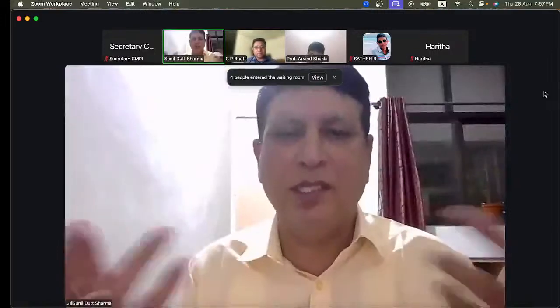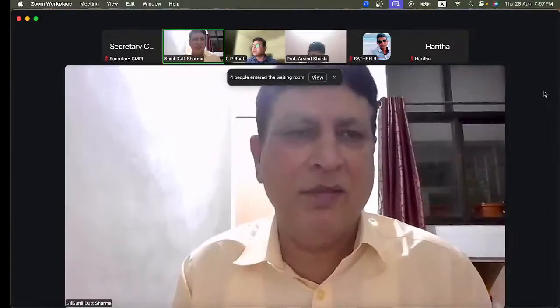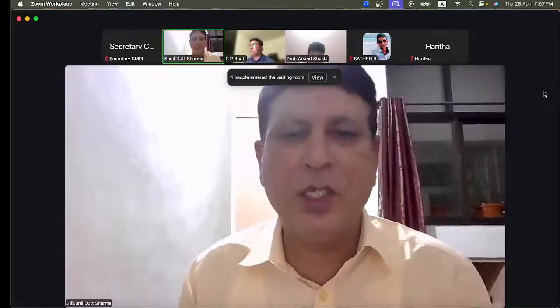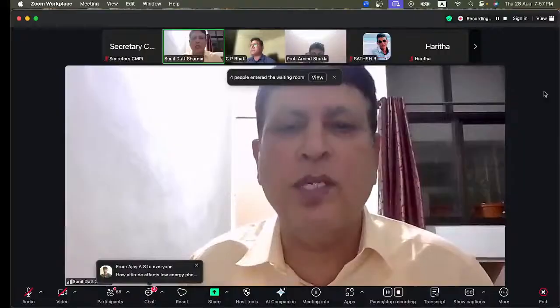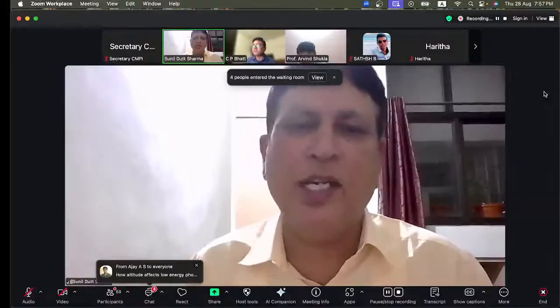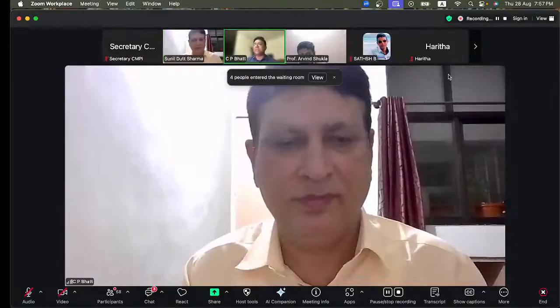No. I think probably they have listened to it differently. I said very clearly, when you are using the polarity which has been used by the calibration laboratory, then there is no need of applying a polarity correction factor. This is true even for external beam therapy also. But if I am using a different polarity, then the polarity correction factor is required.